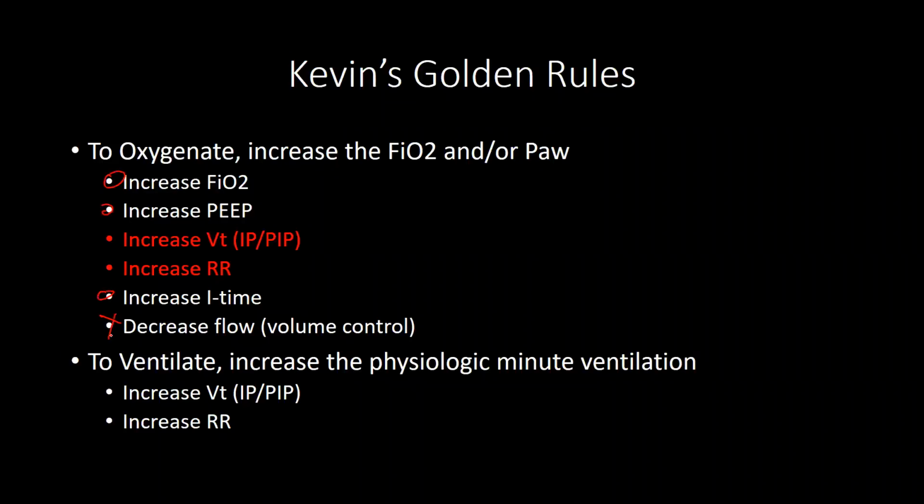Okay, and probably not that. But you're going to pick one of those. If you need to ventilate, you're going to pick one of these two. But if you're back to the oxygenation problem, you have to oxygenate and ventilate better, you need to pick one of the ones in red, because those are the same on both. These two are the same as these two. And so that's how you can fix both problems.